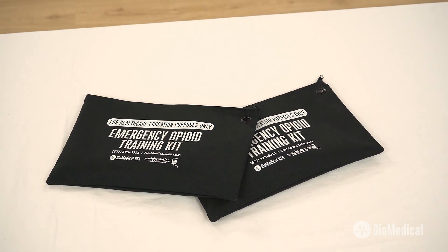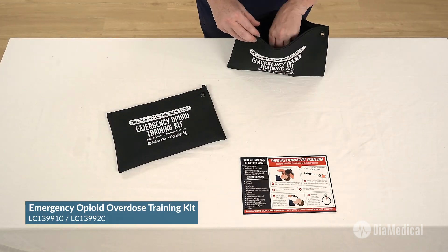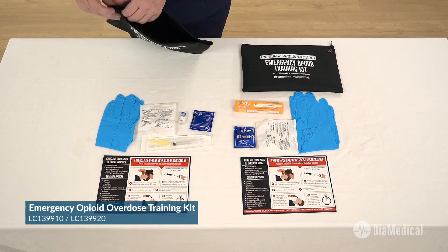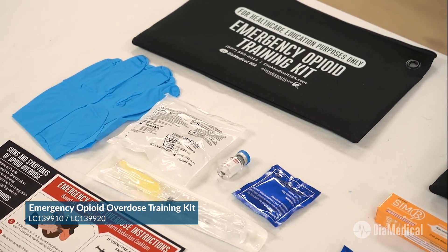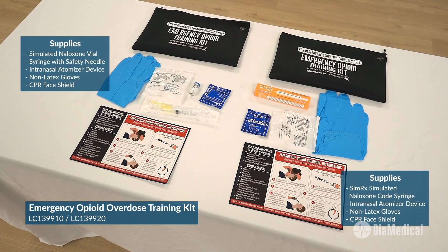SimLab Solutions Emergency Opioid Overdose Training Kits contain all of the necessary supplies needed to teach proper IM, IV, and intranasal administration of naloxone. These training kits contain simulated SimRx naloxone, an intranasal atomizer device, non-latex gloves, and a CPR face shield in a soft-sided bag.